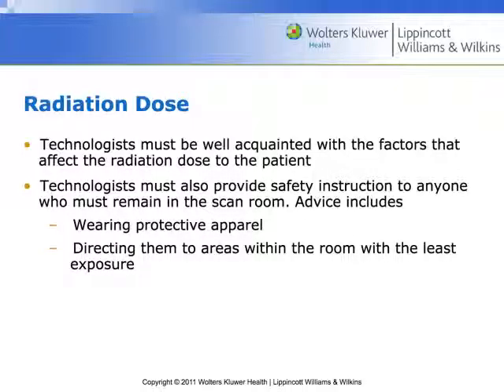And from that point we can also measure at the outside on either side and at the top and the bottom, so we know what a skin dose is when we measure on the outside, and we know what that central dose is when we measure from the inside. These kinds of measurements are really helpful because they allow us to construct protocols that have good image quality and know specifically what the patient dose should be related to that without ever exposing anyone to any radiation. So when we're developing new protocols, we go through this exhaustive process of measuring radiation dose against image quality with a phantom before we ever start irradiating patients.